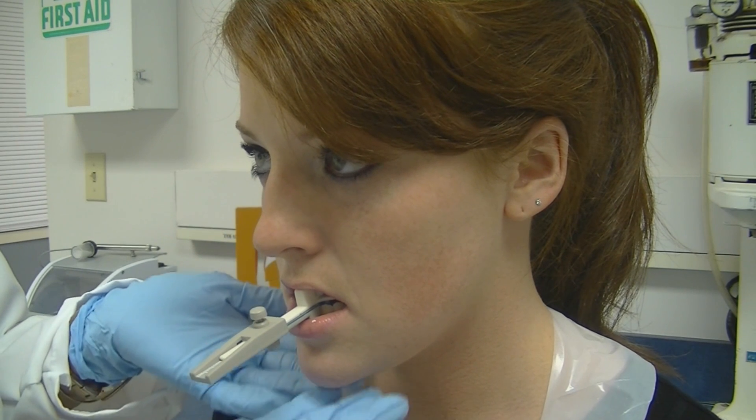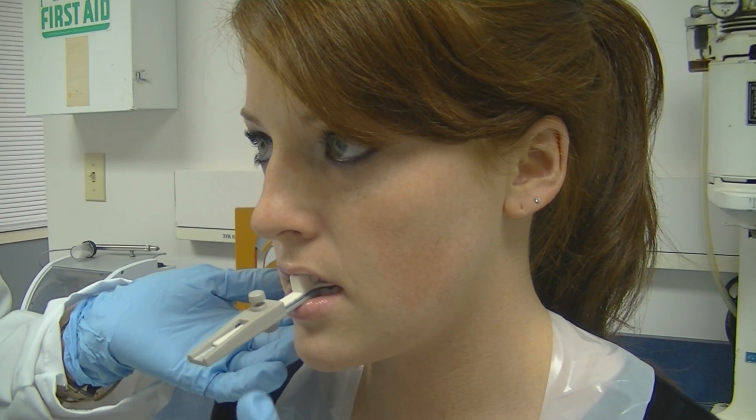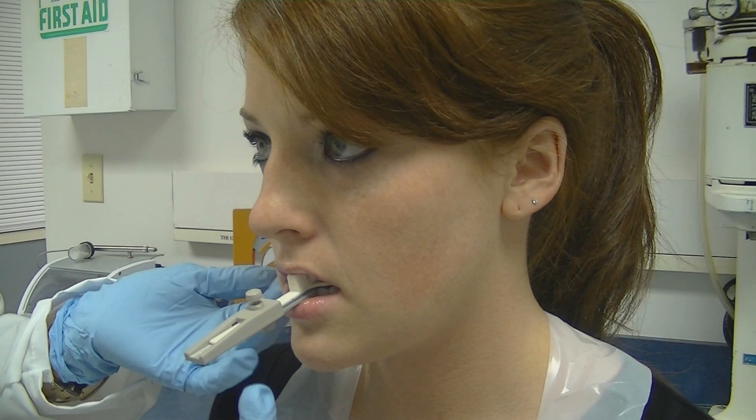Once you have achieved your two locations, you will add those two together and then deduct 65% or 50% — wherever you want to start your patient. Most times it is at 65% of the patient's maximum protrusion.